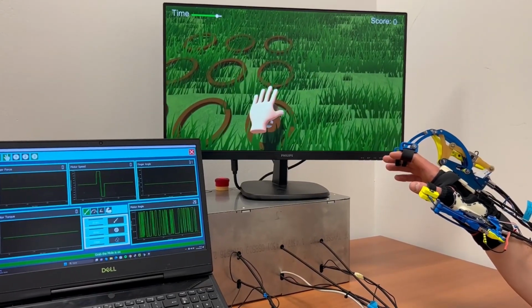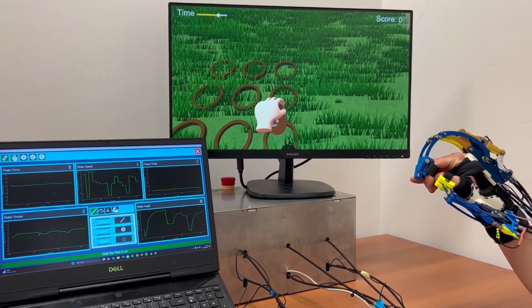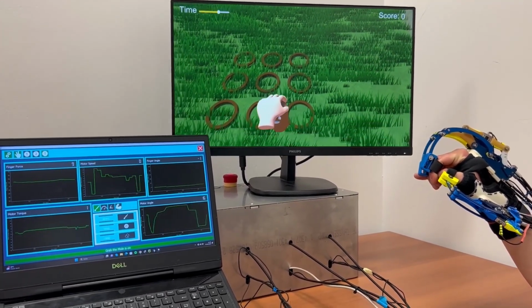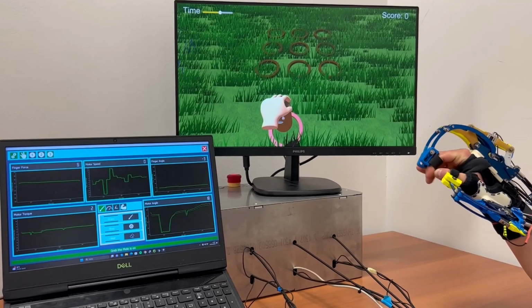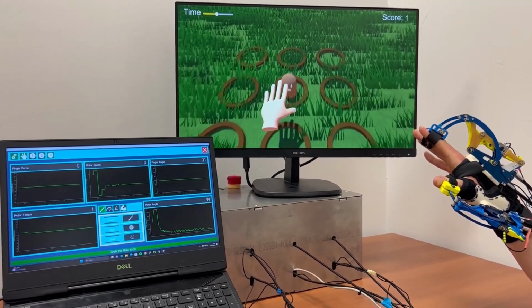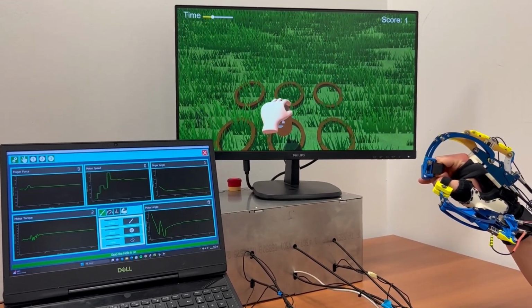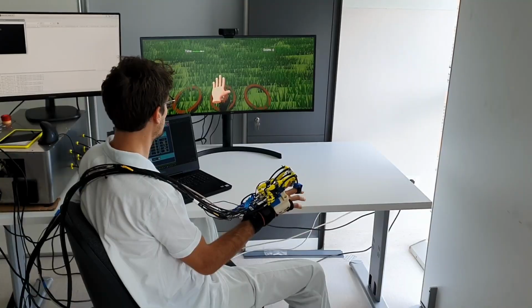After a stroke or a brain injury, the most difficult abilities to recover are the ones of the hand. Controlling the hands requires a large amount of brain resources because of their large number of degrees of freedom and their high sensitivity, resulting in their surprising dexterity. This complexity needs to be matched by comparably sophisticated rehabilitation devices.